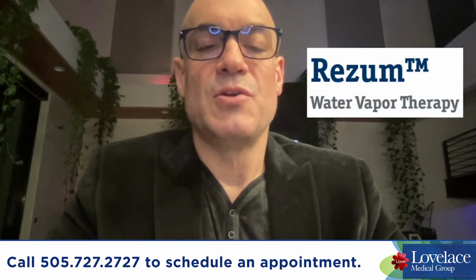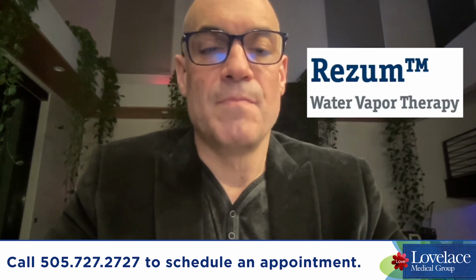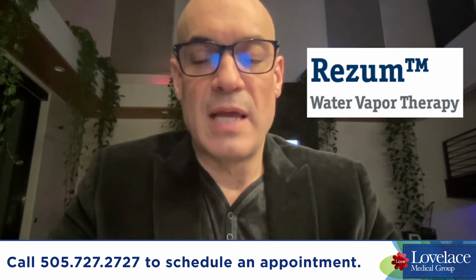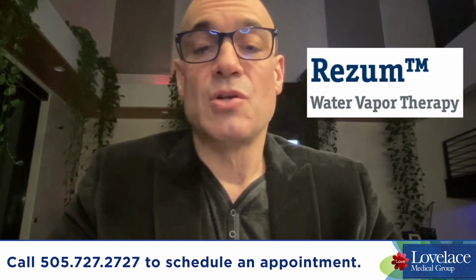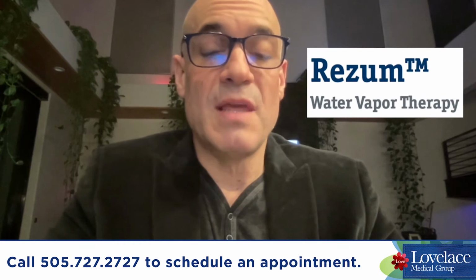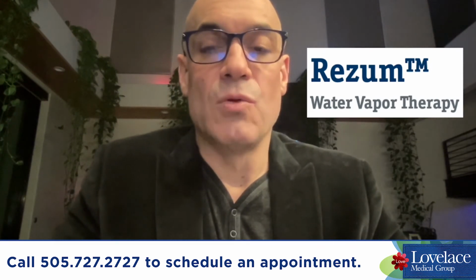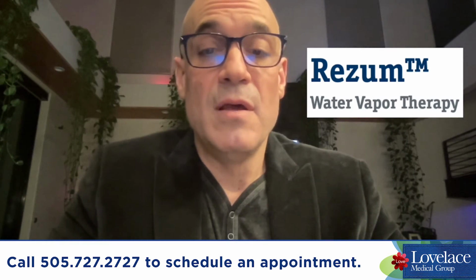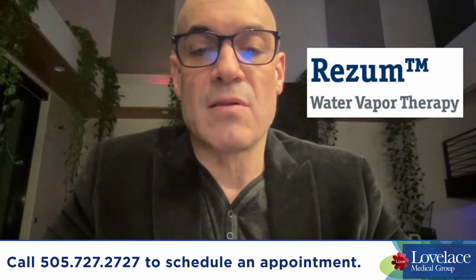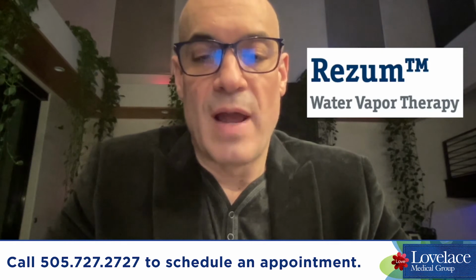The Rezum procedure delivers its energy by heating water into steam. The steam that's injected into the prostate causes tissue ablation. After the tissue is ablated, the body reabsorbs this tissue, causing a physical defect through the prostate. Rather than pushing it up and out of the way, such as the Urolift, the Rezum has a more durable, long-term effect that results in lower urinary tract symptoms.